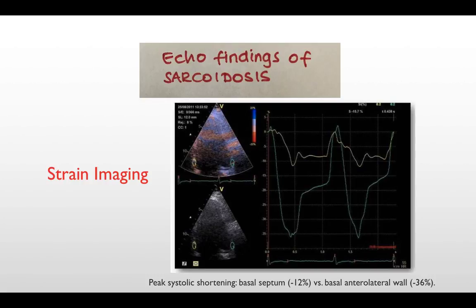If we utilize more advanced echo modalities like strain imaging, we can notice there is reduced peak systolic shortening at the area involved by the sarcoid process. For example, in this patient who had thinning of the basal part of the inferoseptum, if we compare the peak systolic shortening of the basal inferoseptum to the lateral wall of the left ventricle, there is clearly a marked reduction in the peak systolic shortening of the basal septum compared to the basal anterolateral wall.